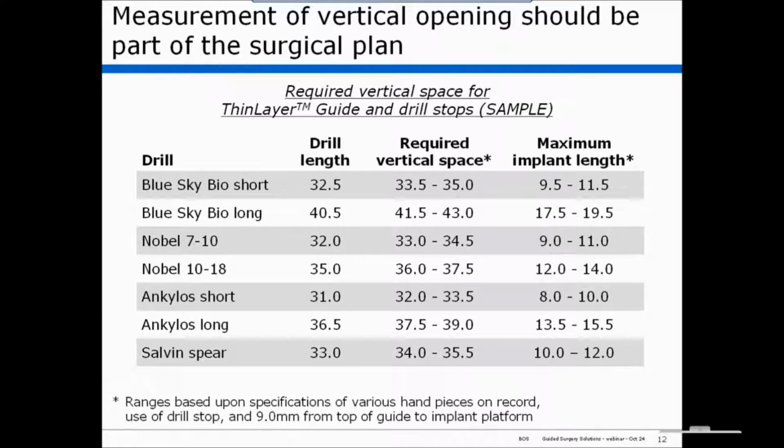And in that way, we can tell you that if you use a drill length, in this example, a Blue Sky Bio short of 32.5 millimeters in a specific handpiece, we can say, well, under those circumstances, your maximum implant length is 10 millimeters, say.